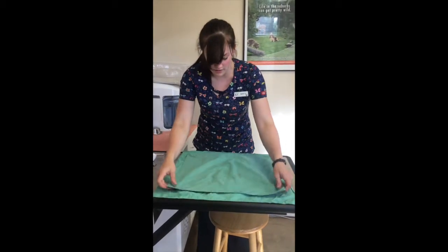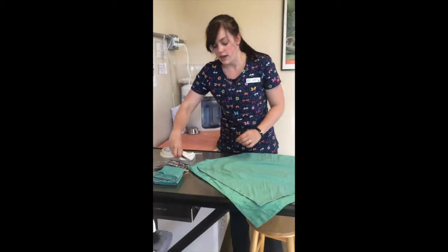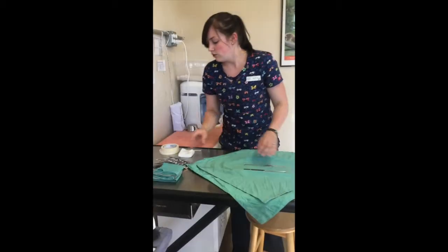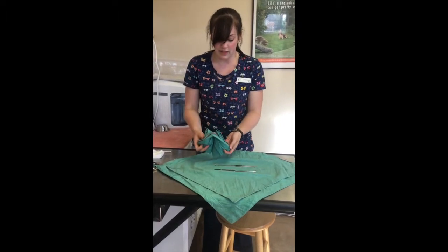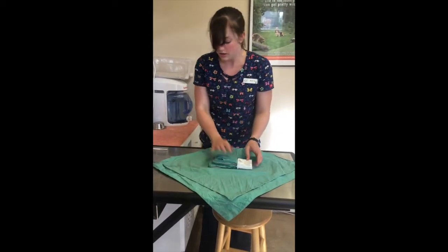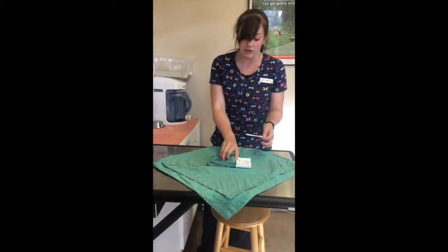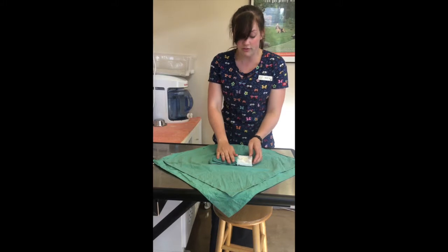Alright, now that that's done, I'm going to go ahead, flatten it, and start putting my instruments inside the pack. So I have my surgical drape. This is a feline drape, so I'm going to set that inside the pack. I have my stack of gauze and my needles, and then I have my indicator strip, which will tell the doctor if the pack is sterile on the inside. So I'm going to place that in here, roughly towards the very center of the pack.